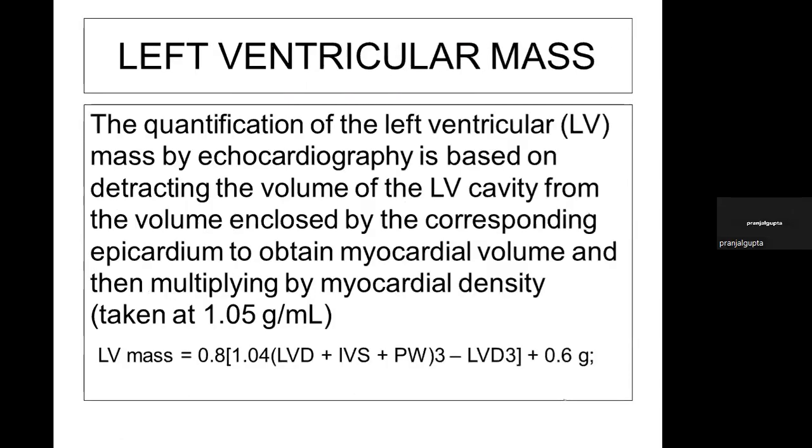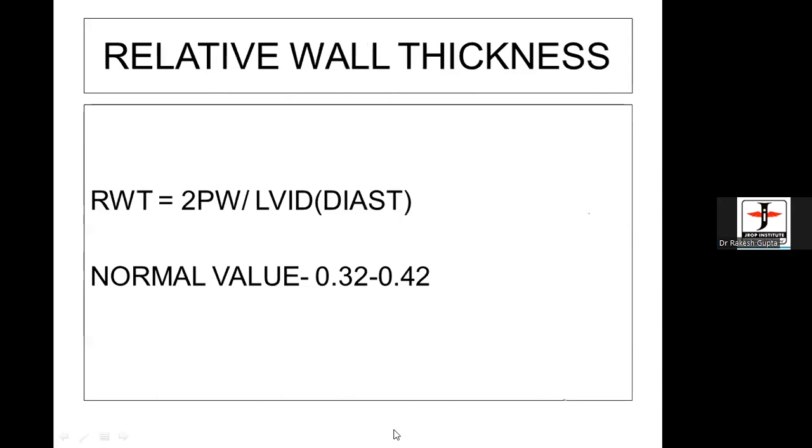Some of your lectures on YouTube, you have written 12 mm. I do write 12 mm or more, but what I'm talking of at this moment is when we really consider them hypertrophic. Anything more than 12 is considered hypertrophic to be true. But issues are there, many variabilities are there.